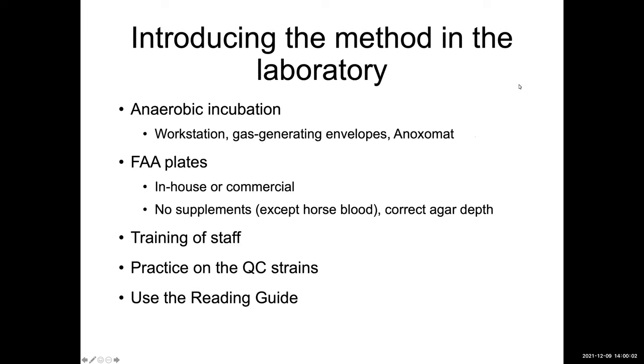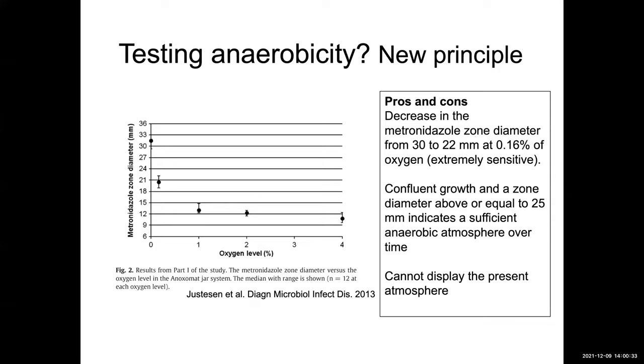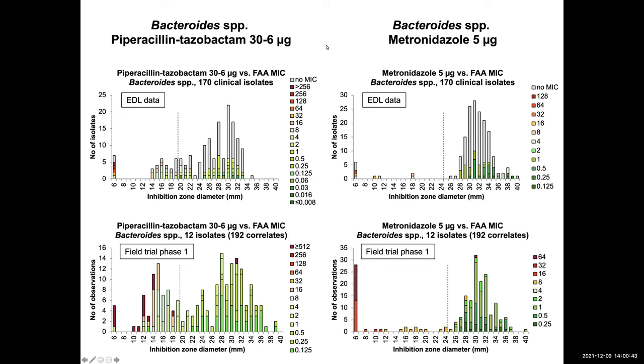And I think for now, the last question I have is, Piperacillin tazobactam for Bacteroides that you showed, a bit problematic for the phase one as far as the range of testing. Now, were these antimicrobials tested sequentially in different phases by the labs? For instance, was Piperacillin tazobactam one of the first sent out to the laboratories, or was phase one really inclusive of all of the different bug drug combinations? It was the latter. So they just got the collection and they tested all the agents at the same time.